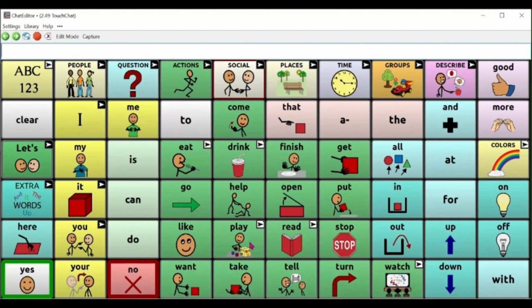So, this is a great tool to support their communication and support their language growth. AAC really helps to close that language gap because our receptive language and our understanding of language comes before expression. Research has shown repeatedly that AAC can help facilitate the development of speech. And a multimodal communication approach is always encouraged.